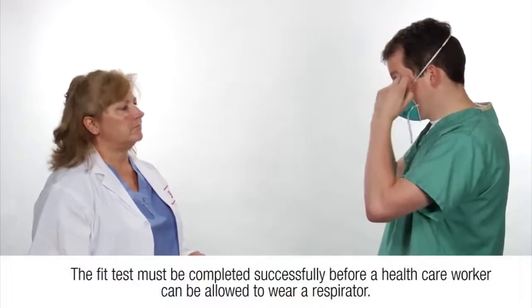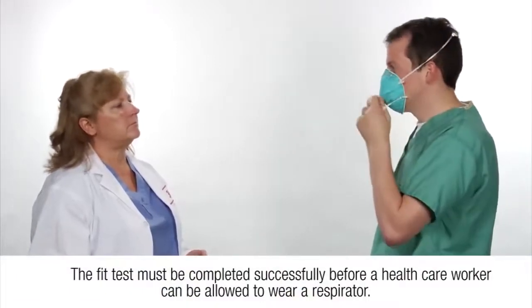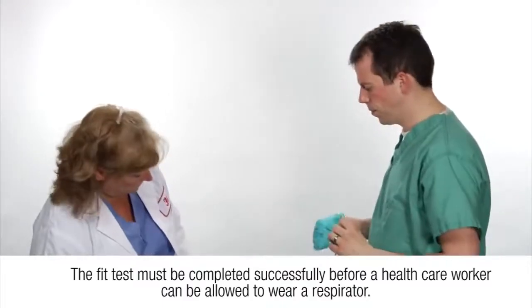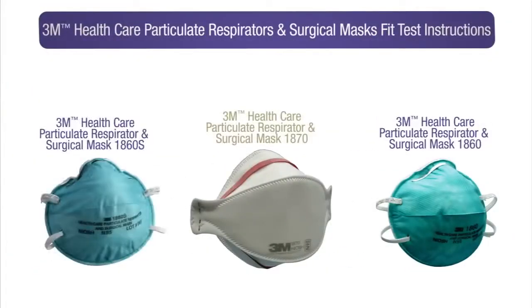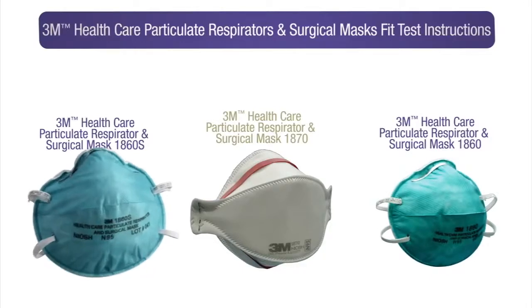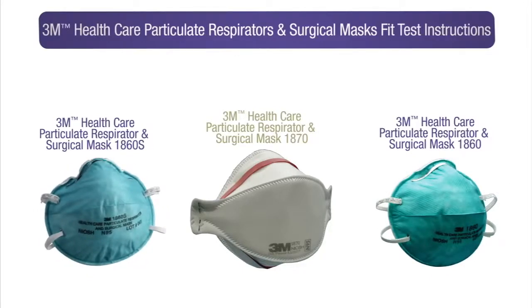The fit test must be completed successfully before a healthcare worker can be allowed to wear a specific model respirator. One commonly used strategy is to fit test all employees on a single respirator model. Those who cannot achieve an adequate fit are then provided another model. For example, you may choose to fit test all employees on a 3M 1870 respirator. Those who cannot achieve an adequate fit after several tries are then provided a 3M 1860 respirator or a 3M 1860S respirator for employees with smaller faces. The fit test procedure is then repeated.